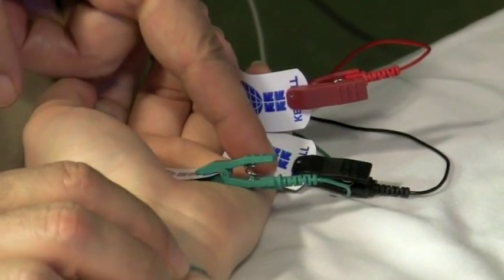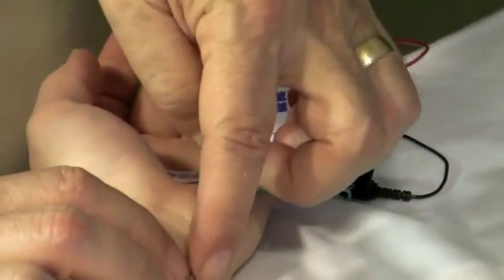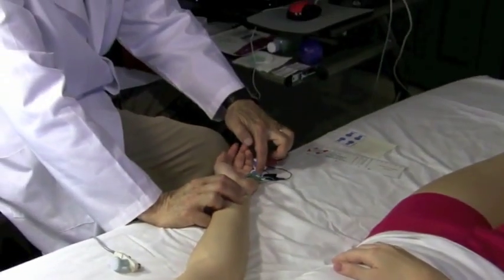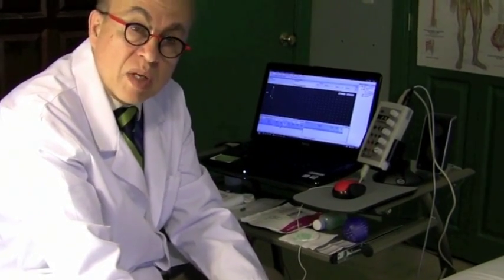That's 1.75 1,000th of a second. It's extremely fast. So it took the electricity 1.75 milliseconds to travel from here to here. Okay, if that's how long it took, how much distance did it travel? The distance that it traveled is 11 centimeters or 110 millimeters.